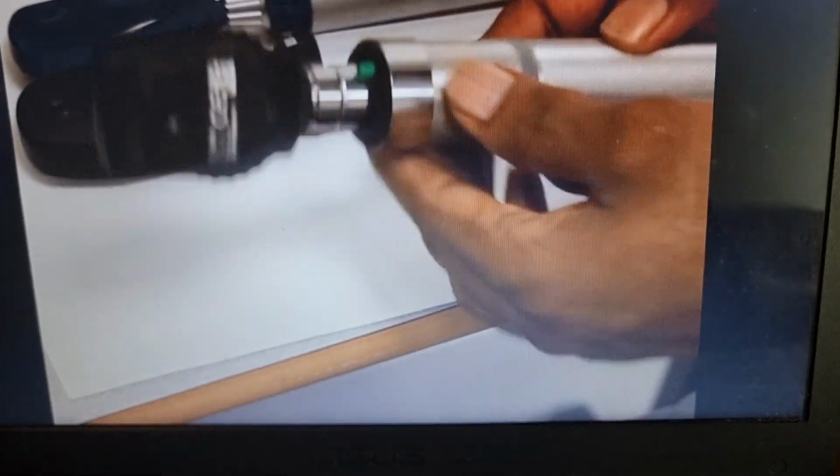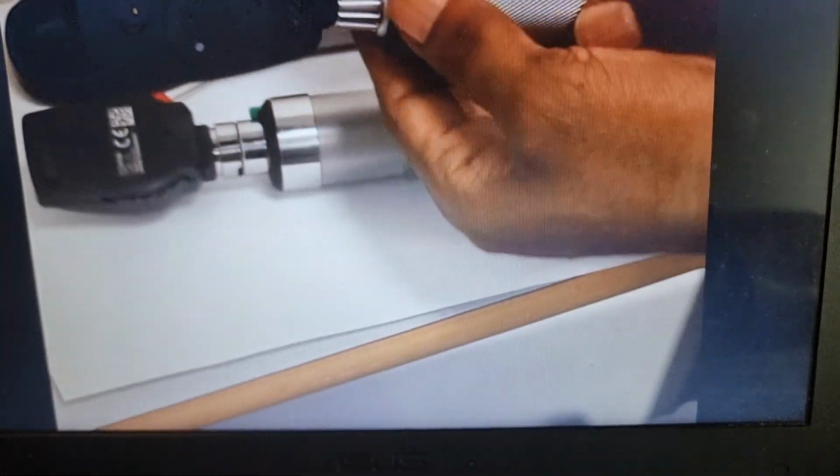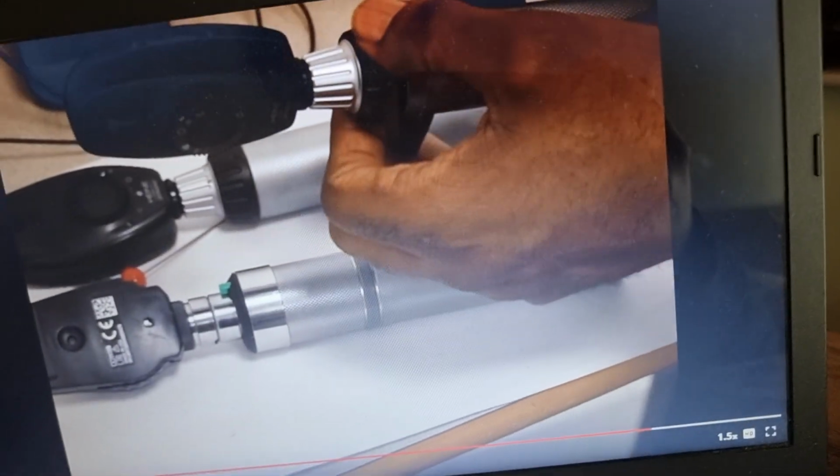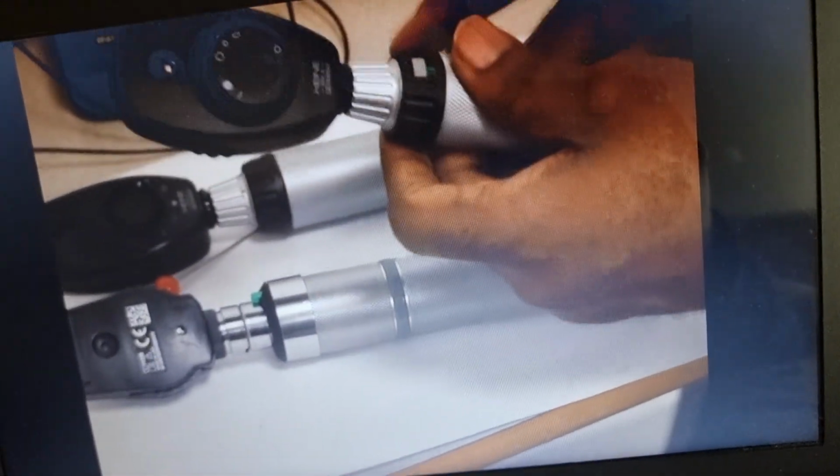So, to recap, again, we have got 3 controls. 1, to turn it on and off. It's off, it's on. You have to press it to turn it. If you don't press it, it will not move. Okay, on and off. Next is to look at the lens.